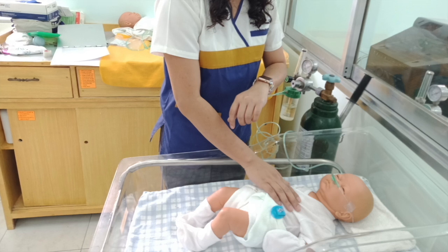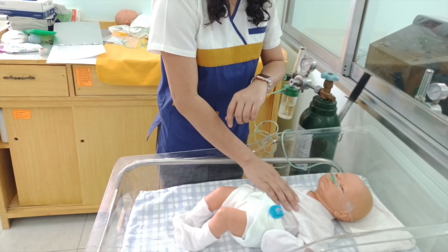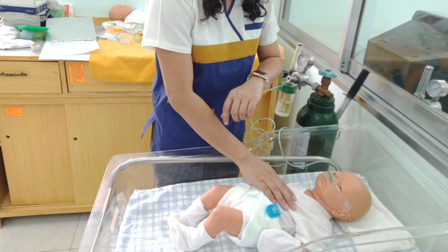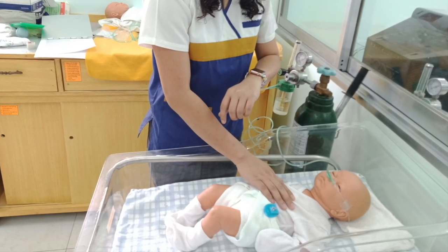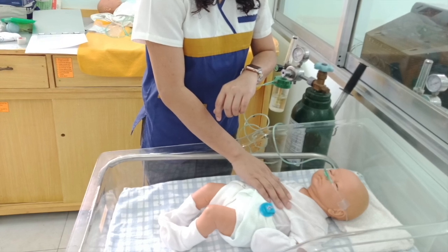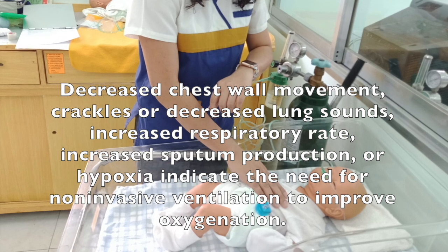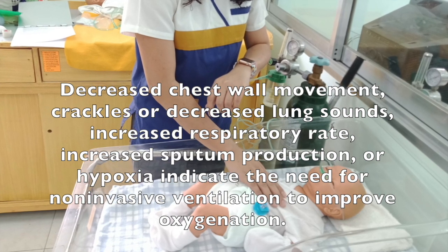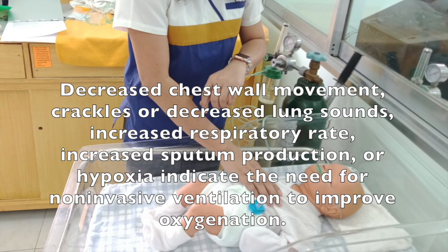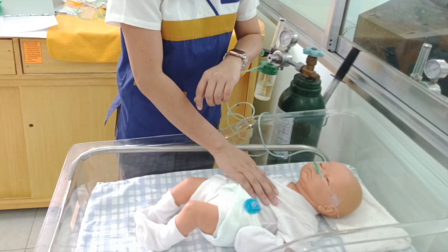Assess immediate respiratory status, including symmetry of the chest wall expansion, chest wall abnormalities, temporary conditions affecting ventilation, respiratory rate and depth, sputum production, and lung sounds. Decreased chest wall movement, crackles, or decreased lung sounds, increased respiratory rate, increased sputum production, or hypoxia indicate the need for non-invasive ventilation to improve oxygenation.